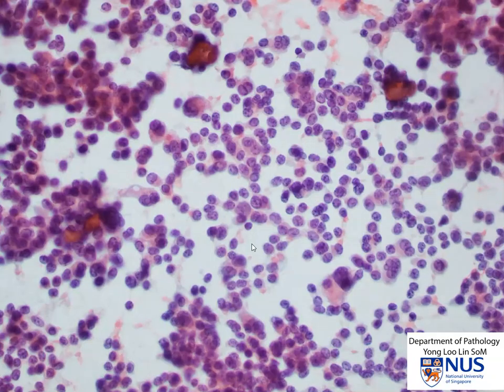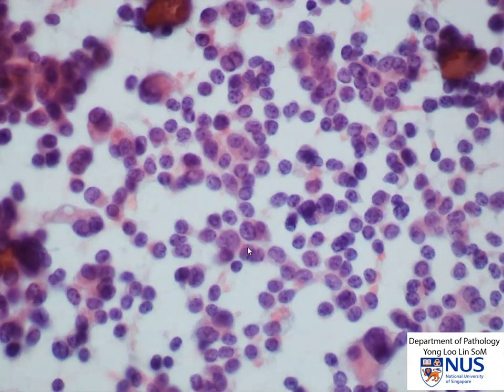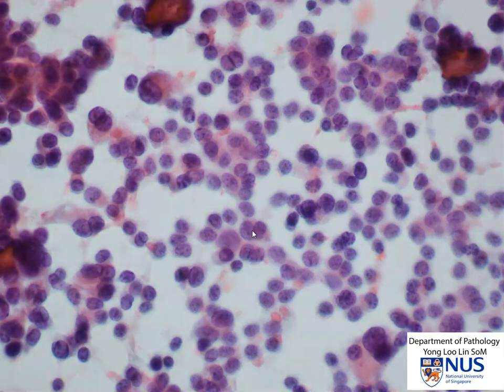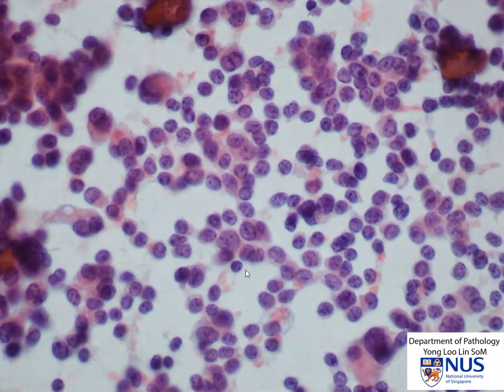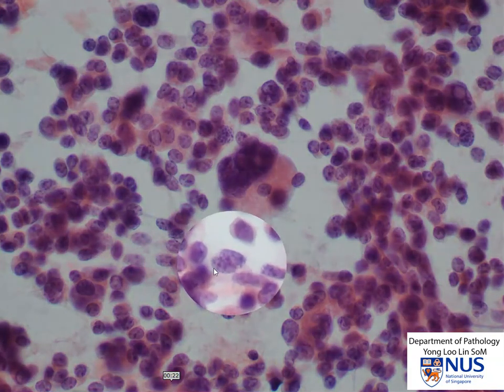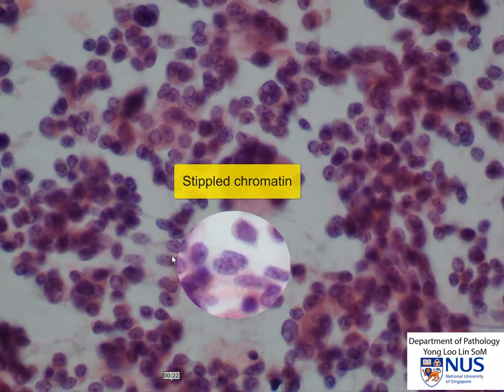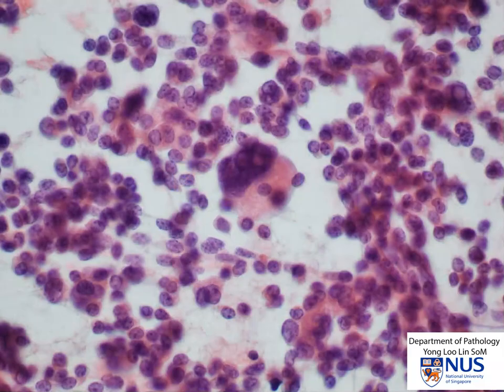We begin to appreciate the chromatin more at higher magnification. It is quite uniformly dispersed and granular. In this field, there are some large, giant, multinucleated cells. Here is a good example of a cell where you can see that the chromatin is quite stippled, perhaps having a salt and pepper appearance.